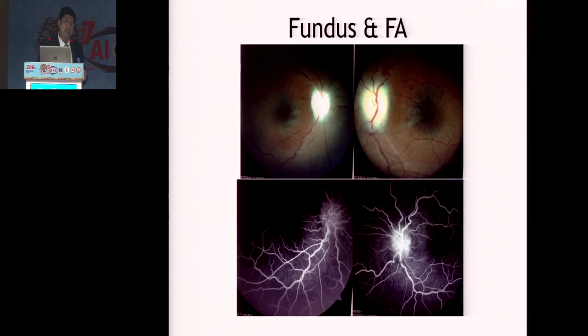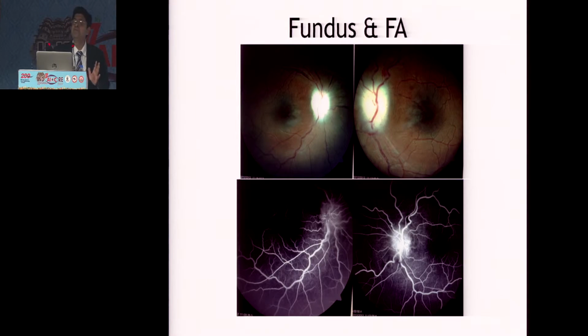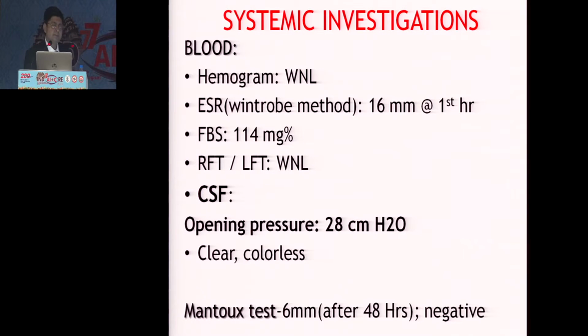Whether we want to do anything was actually the decision we wanted to take. This was the fluorescein angiography. Usually you don't need to do a fluorescein angiography. I mean, the diagnosis was certain, but we did it just to see, is there any perfusion in the optic nerve head? The key was, is there some function you could think of salvaging? The vision is hand movements. Are you going to intervene just for your own ego? But the rest of the investigations were normal.